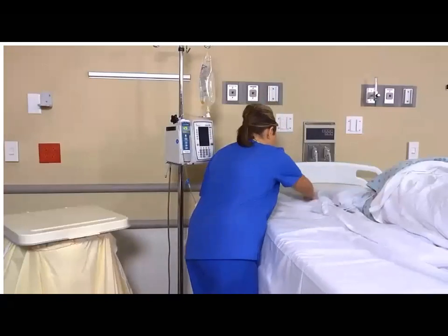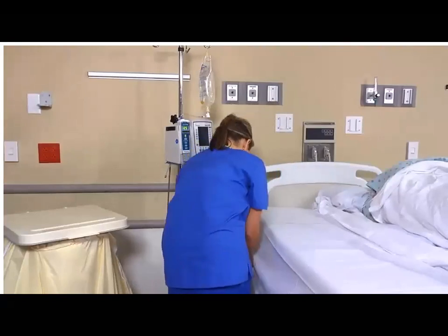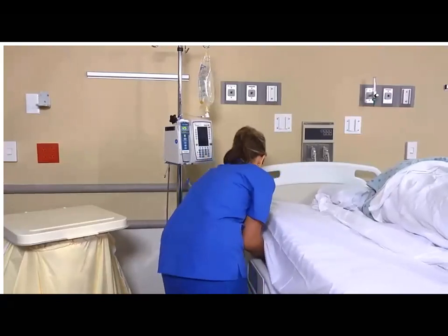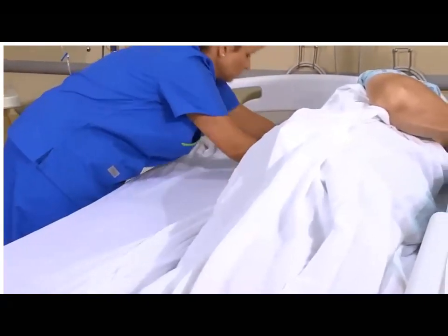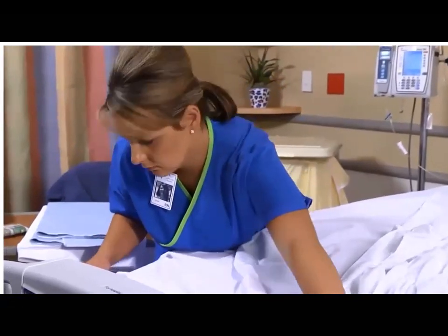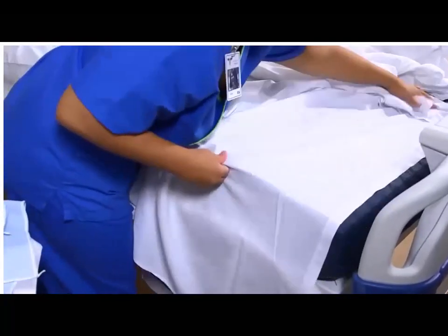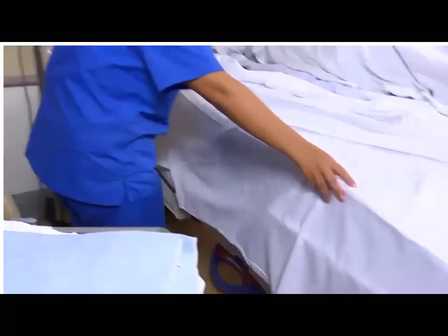Next, apply clean linen to the exposed half of the bed in separate layers. First, place the fitted bottom sheet on the bed lengthwise. Secure the top and bottom corners on the near side and fan fold or roll the remaining fabric along the patient's torso. If you're using a flat sheet, allow it to hang about 25 centimeters or 10 inches over the edge of the mattress. Be sure that the lower hem of the bottom sheet lies seam down and even with the bottom edge of the mattress.